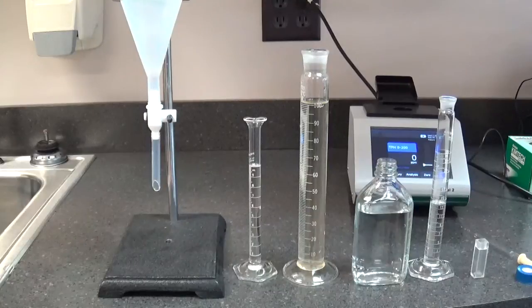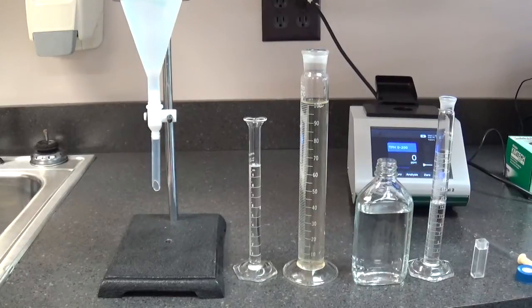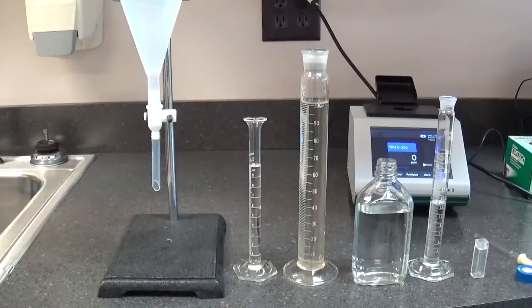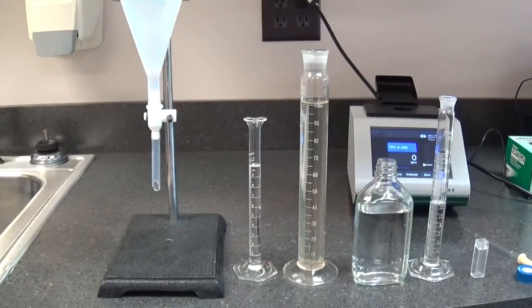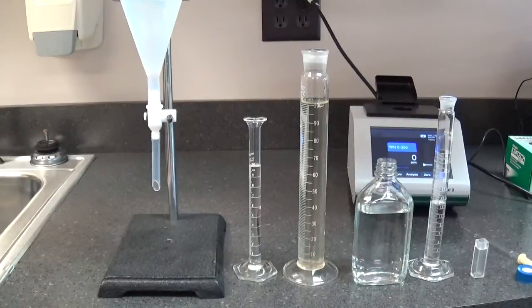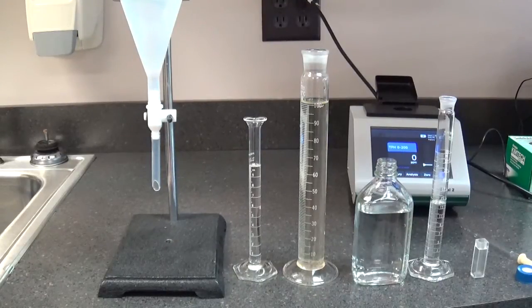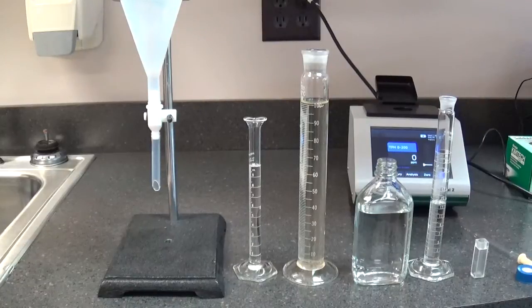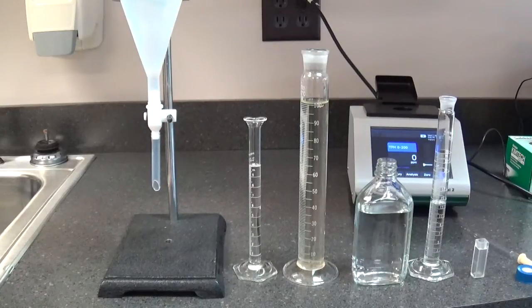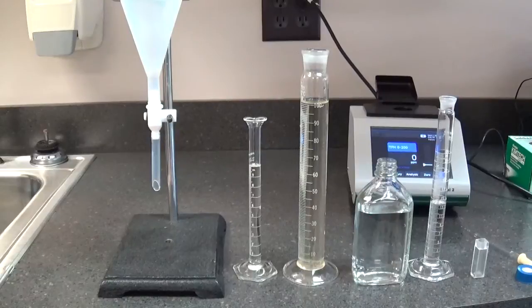Sample analysis. Make sure all glassware is clean. Any residual hydrocarbons in the glassware and sampling containers will be extracted and added to the TOG or TPH readings. Glassware cleanliness can be checked by rinsing it with solvent and then put the solvent rinse in the quartz cuvette and make sure it reads zero. Any positive reading means your glassware is not clean.